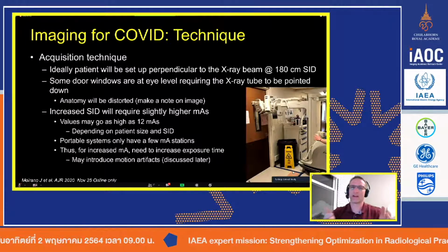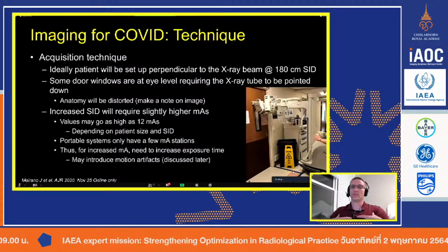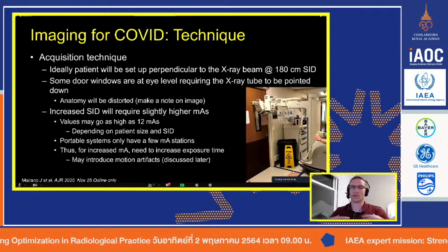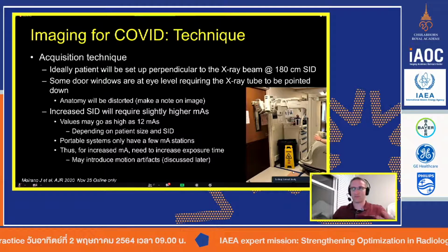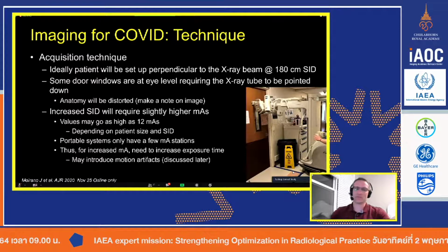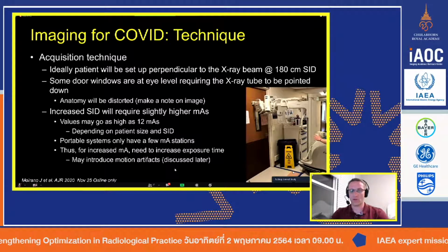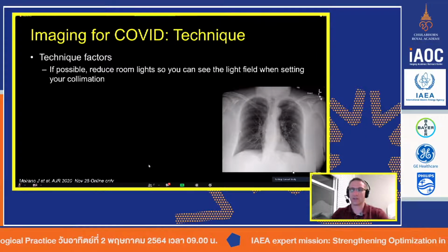So the problem with that is the longer the beam is on, there is obviously a lot of motion going on. They probably can't hold their breath. If they can hold their breath, that's great. But if they can't, there's involuntary motion. You've got cardiac motion, you've got lung motion. If the people are sick and they can't stand as well, or even if you sit here perfectly for a minute or two, you'll just kind of fidget. People just don't normally sit still for a very long time. And so the longer the exposure time, the greater chance for motion artifacts. And unfortunately, there's just not a lot we can do about that.